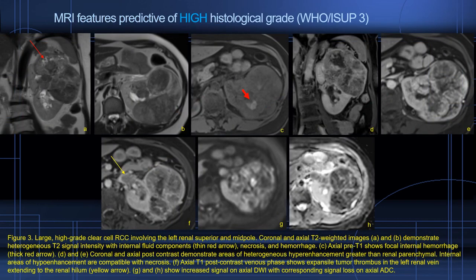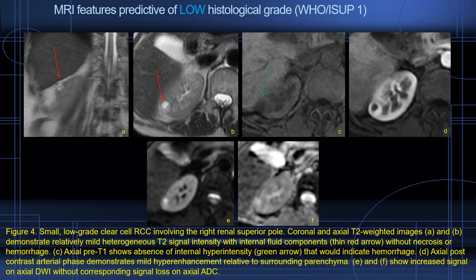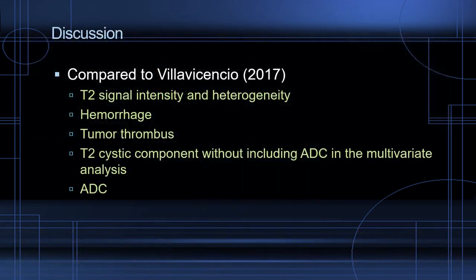A different patient also with high histological grade demonstrating similar imaging features. These MRI features are absent in a patient with low histological grade. My findings are concordant with a study from 2017 by Villavicencio.